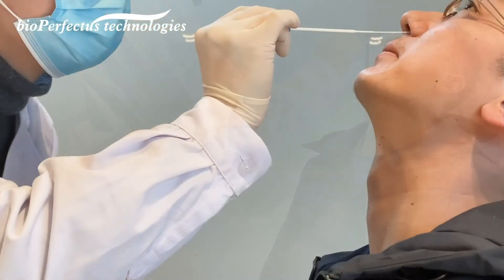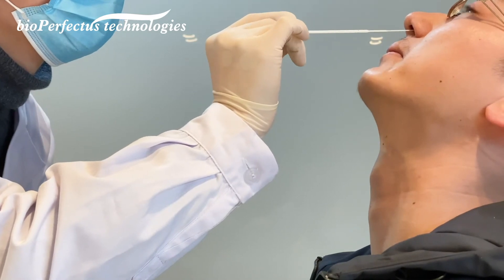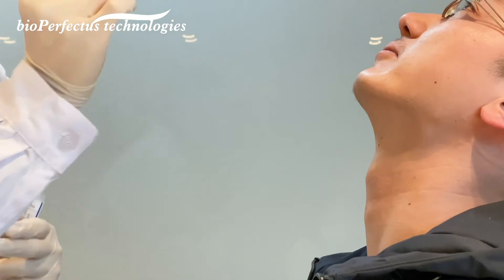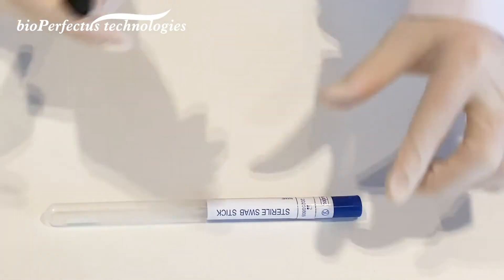Gently rub and roll the swab, leaving it in place for several seconds to absorb secretions. Slowly remove the swab while rotating it. Put the swab back into the protective jacket and write down the subject's name on the label of the protective jacket.